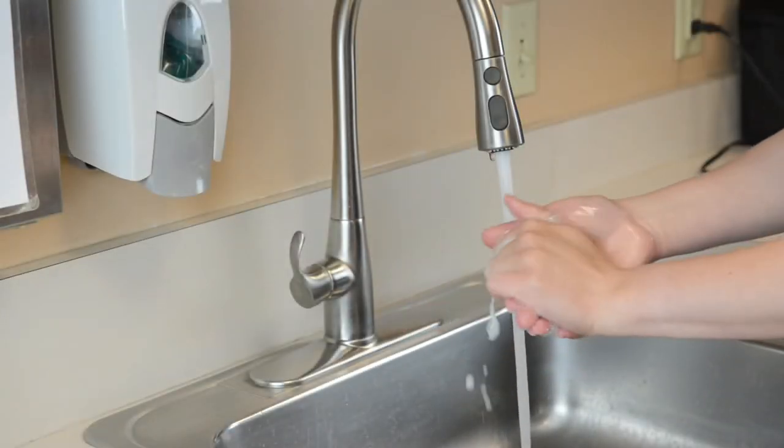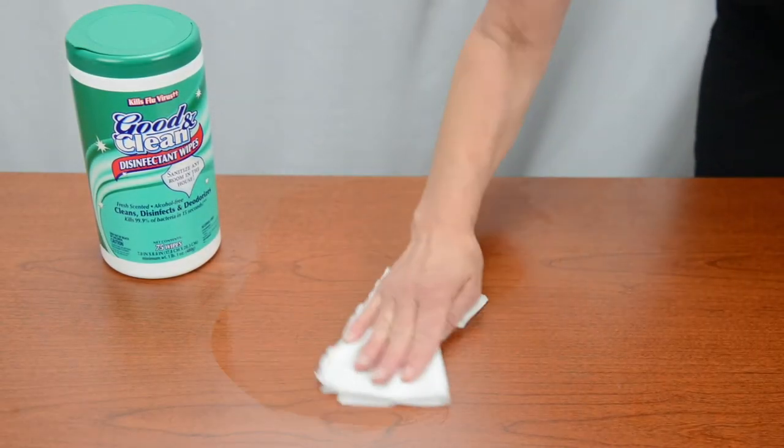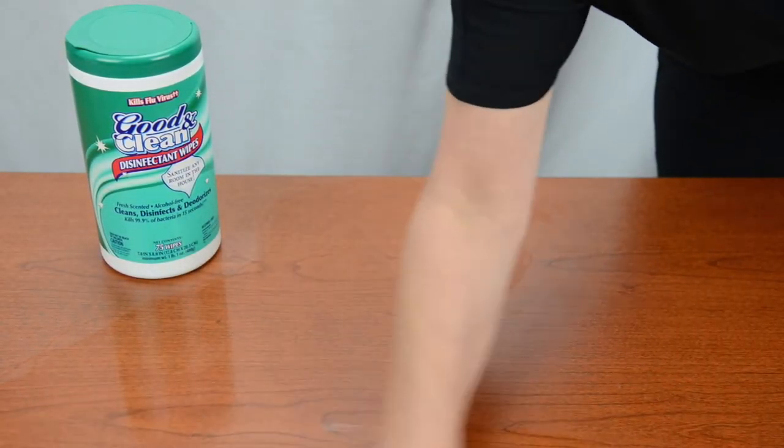To change your child's needleless connector, first wash your hands. Clean your work surface with soap and water or a disinfecting wipe.